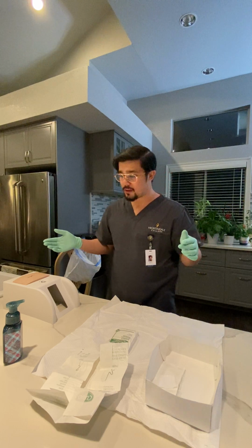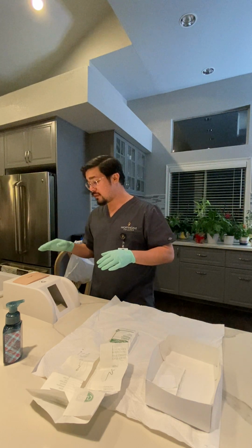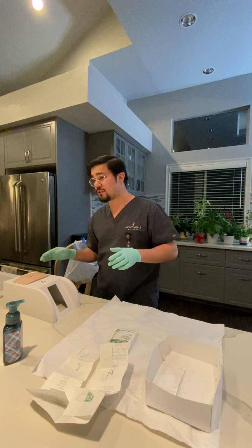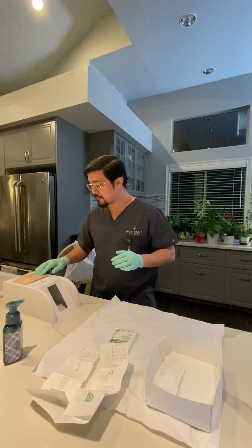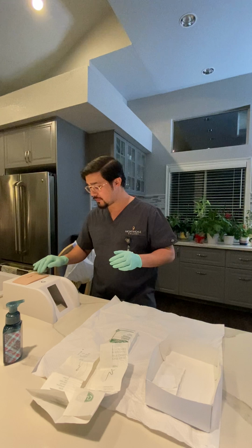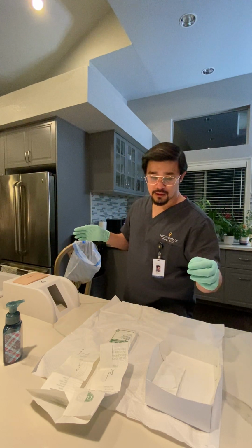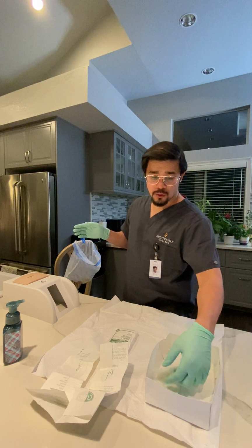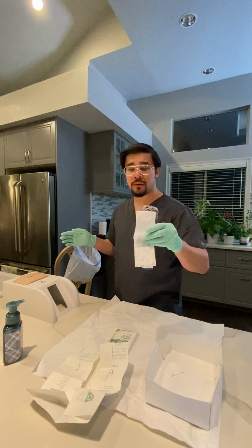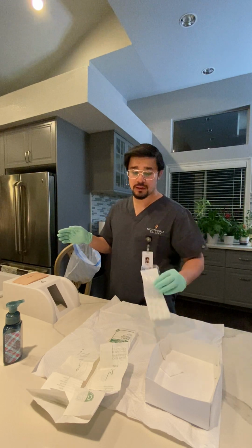I'm going to then assess the wound still. The whole time I'm maintaining the assessment on the wound, I'm looking for any discoloration, any odors, checking the tissue. Then I'm going to palpate one more time, feeling for edema there. That looks good. So now we're going to place the Tegaderm on the patient, which my kit did not have, so I have here a saran wrap in lieu of it. A clear wrap that we would use is very similar to the Tegaderm.